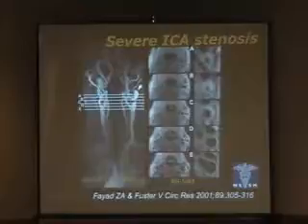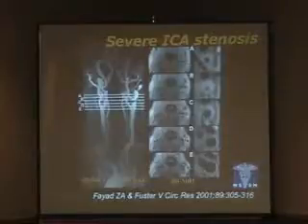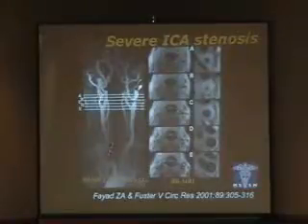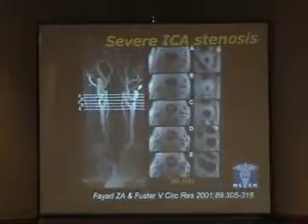What's also very important and critical is that the exam can be performed in a fast fashion, and it can also be combined with other measures of clinical importance, such as shown here, which is a 3D angiogram, performed thousands of times on a weekly basis in the United States and in the world.